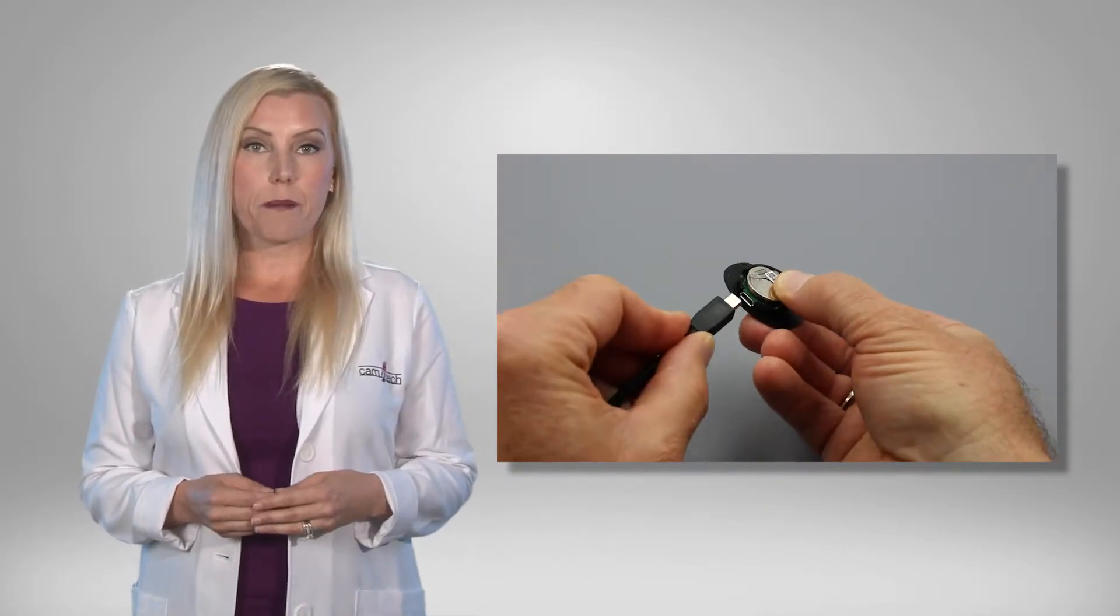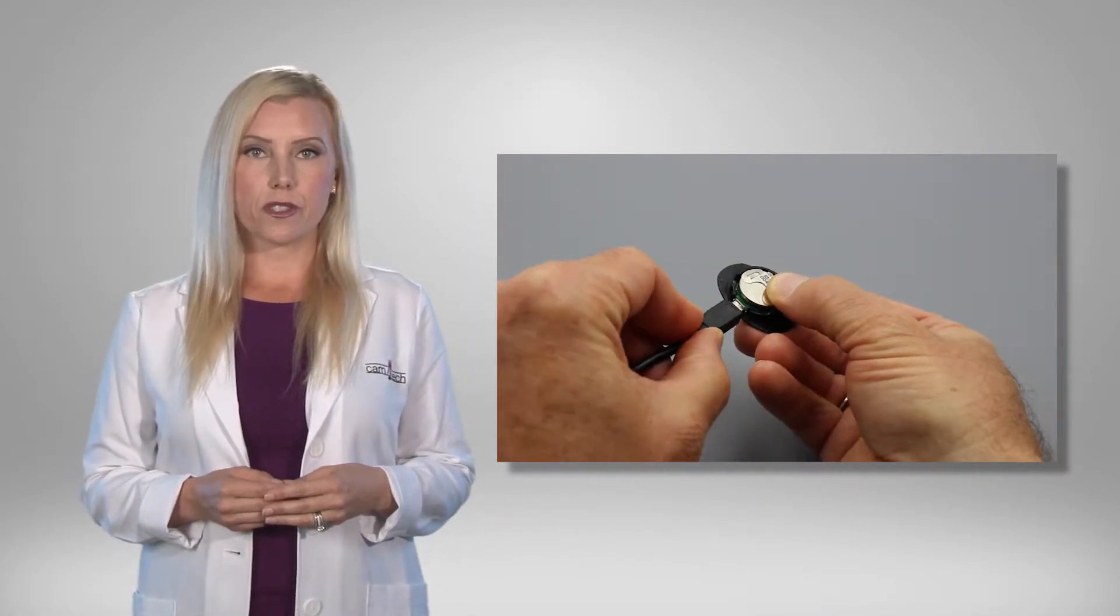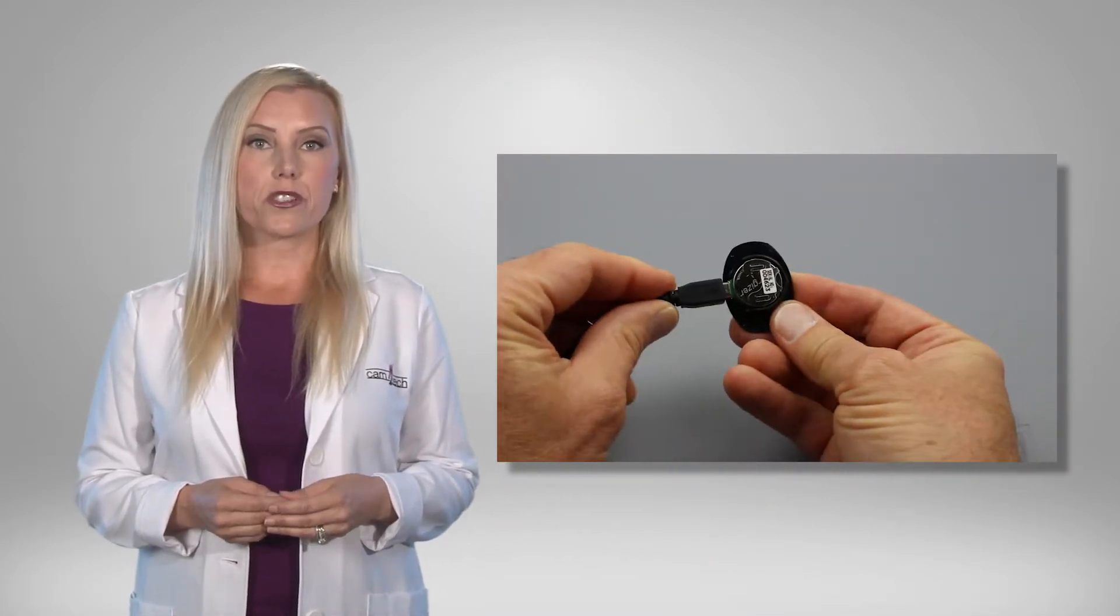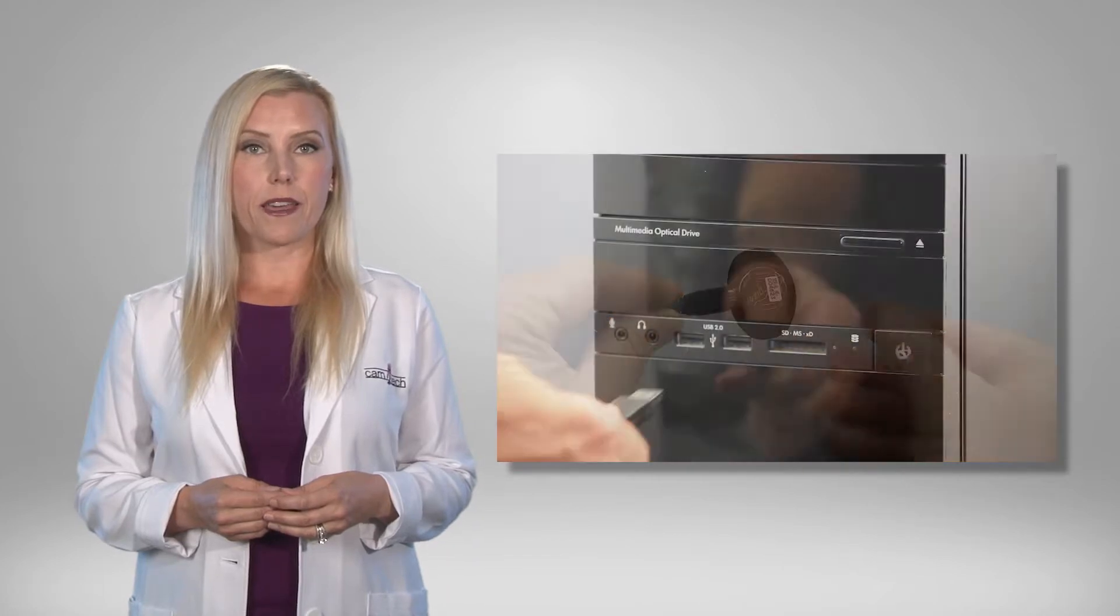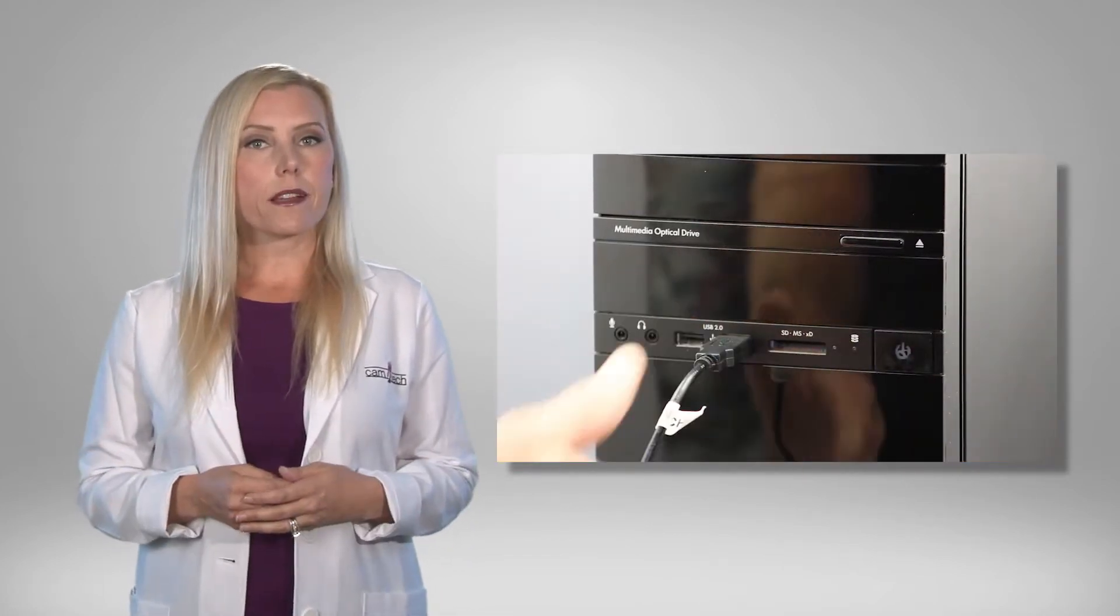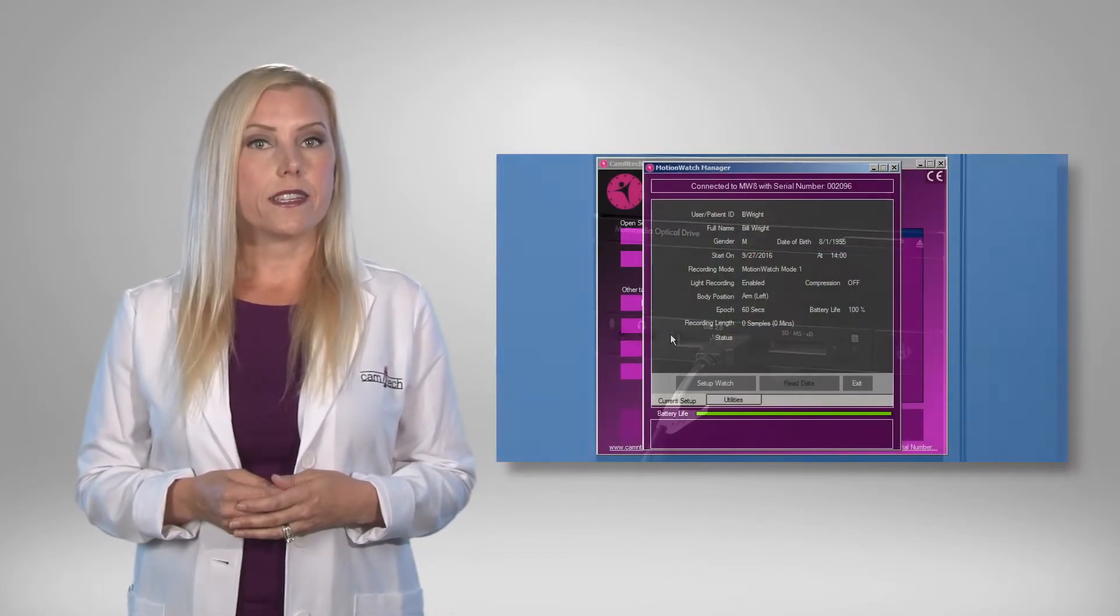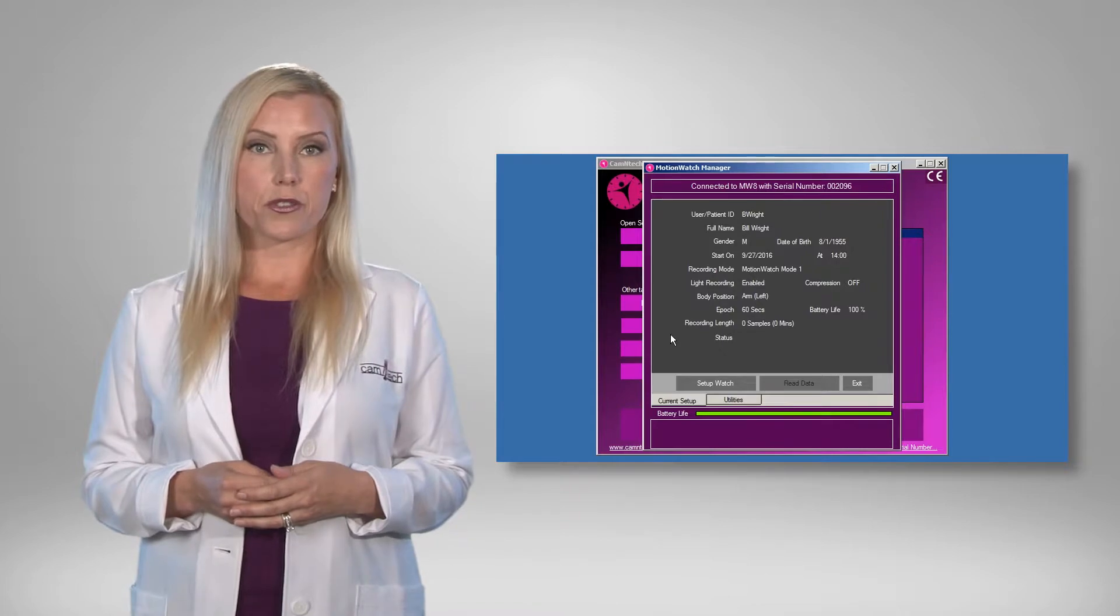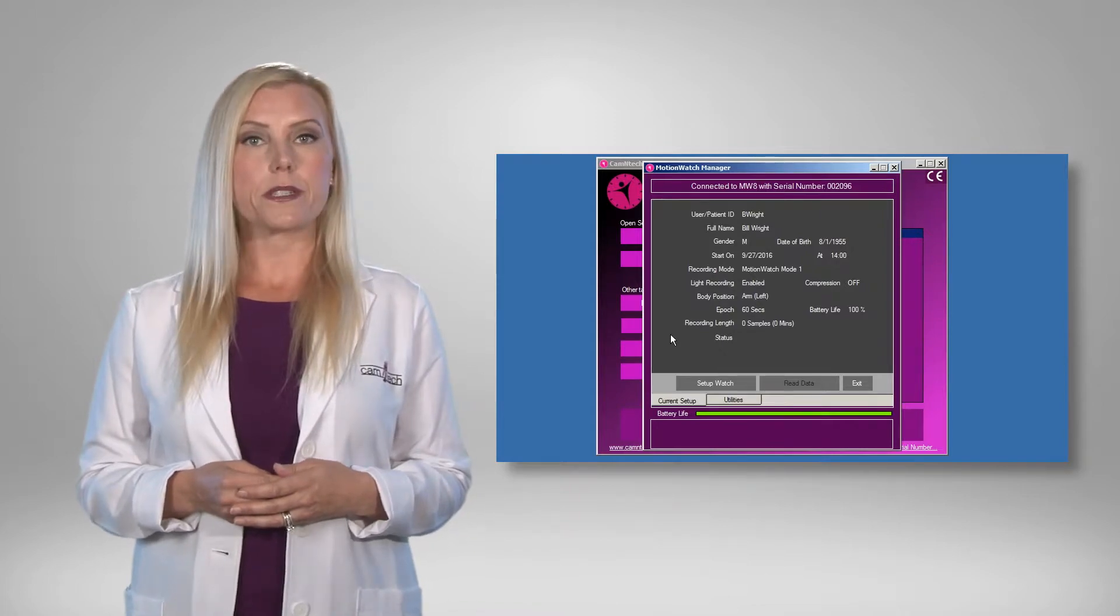Now that the Motionware application is installed, connect a Motionwatch to the USB cable. The watch will automatically be detected and the Motionwatch Manager screen will be displayed.